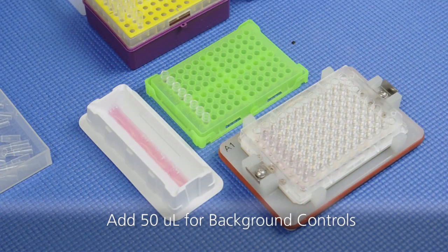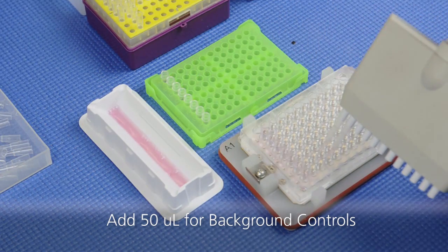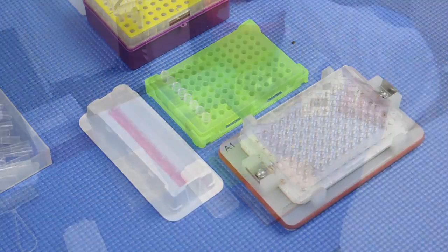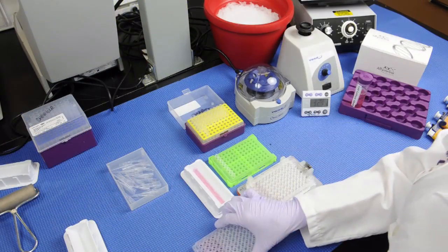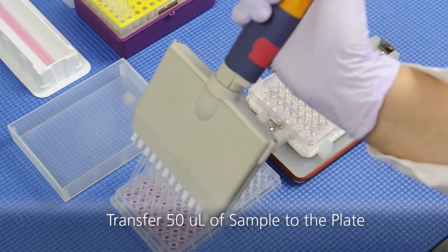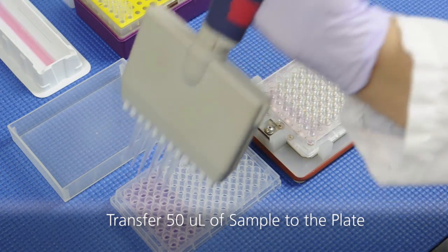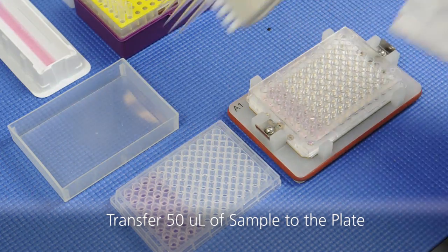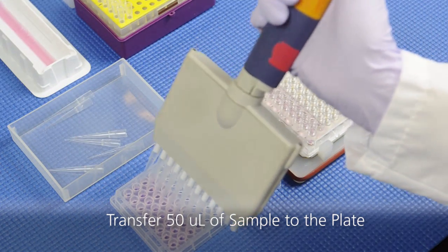Pipet 50 microliters of cell culture media into two wells of the flat bottom microtiter plate to act as the background controls. Next, pipet the cell culture supernatant samples from your source plate into the flat bottom plate.